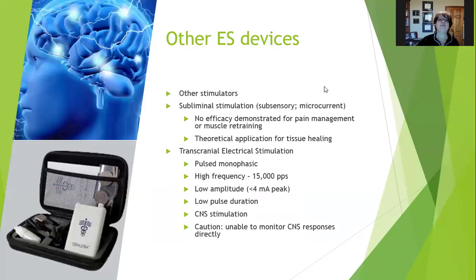So there are other types of stimulators that we are not going to use in lab, even though I'll bring a microcurrent stimulator just so you can try it out just for fun. Some of them are subliminal. Microcurrent is a subsensory application. There's really been no efficacy demonstrated for pain management or muscle retraining. There's theoretical application for tissue healing.